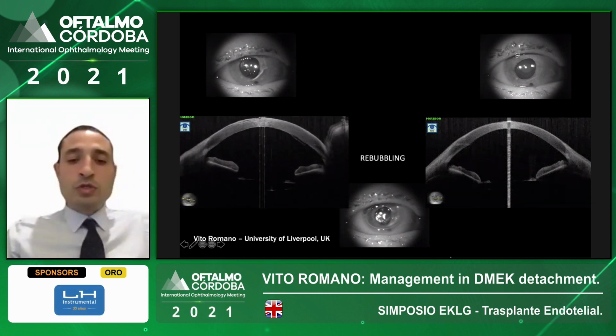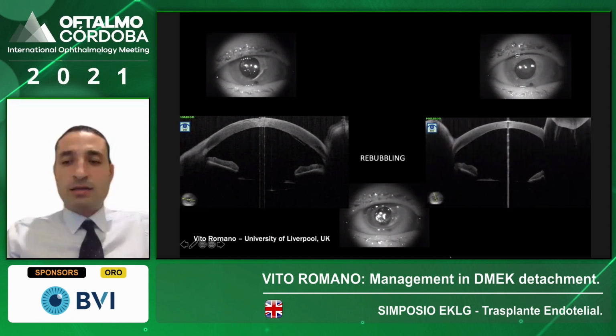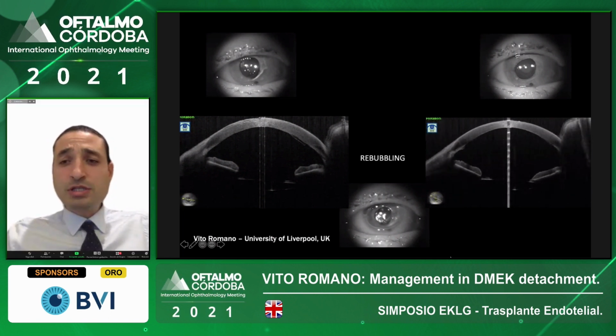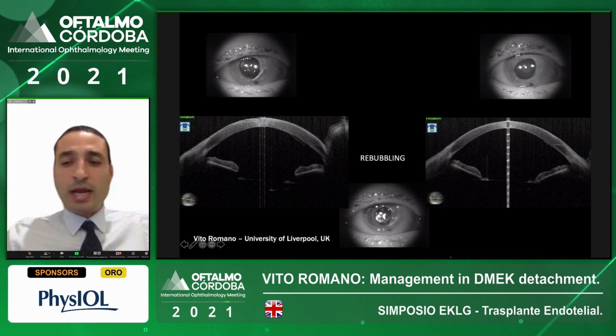And what you do, you can perform a rebubbling at the slit lamp, and then later on, you can check after 1 or 2 days that it is completely attached. It's a procedure that is highly successful, but it needs to be done in a proper way.